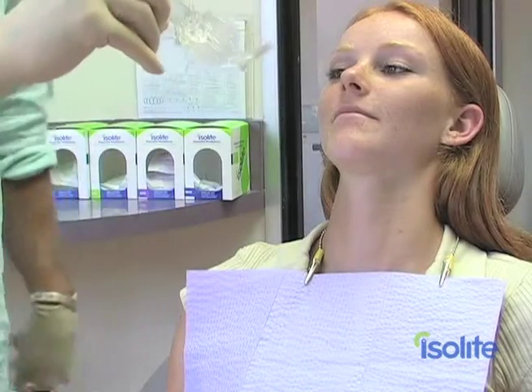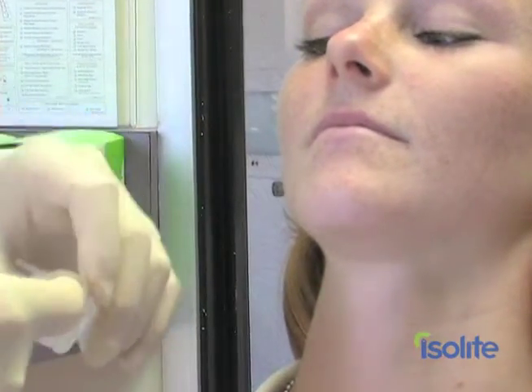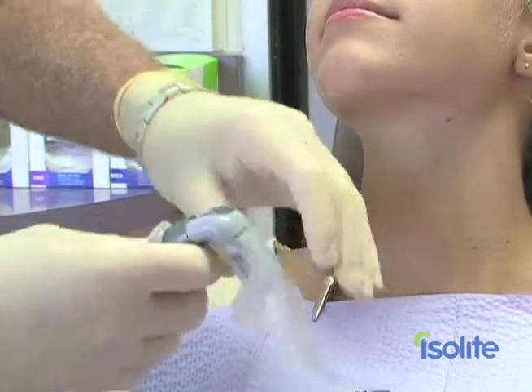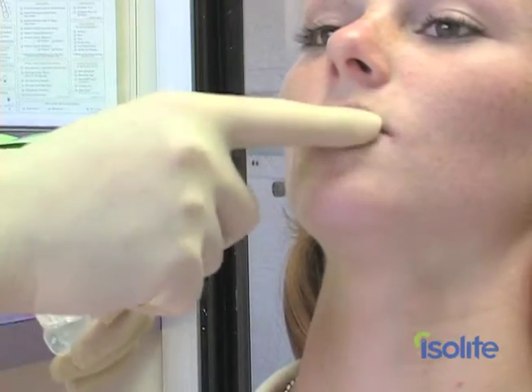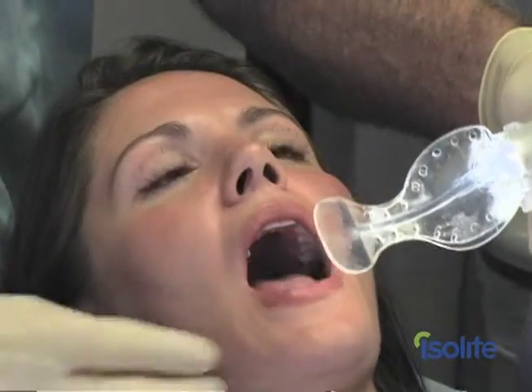Mouthpiece placement is easy to learn, but like any good technique, practice is the key to success. Remove the mouthpiece from its packaging and moisten the inside of the mouthpiece sleeve with Isolite lubricant. Attach the mouthpiece to the control head and make sure that the locking barbs engage. Lubricate the patient's lips with Isolite lubricant and moisten the mouthpiece with the air-water syringe. This will make it slide into the mouth easier.